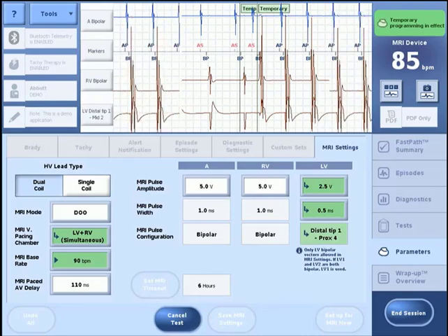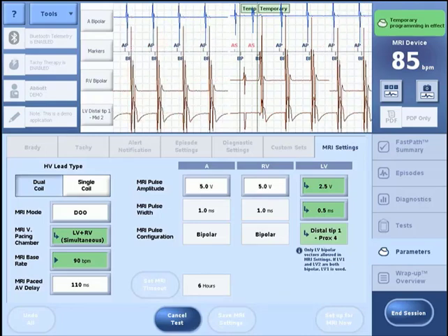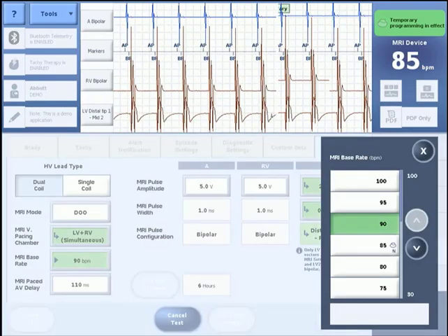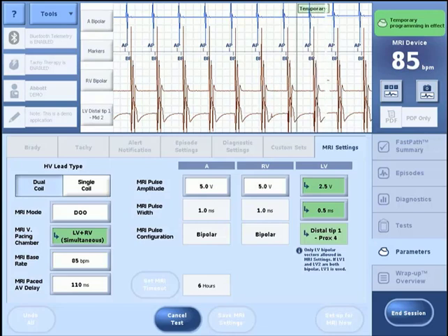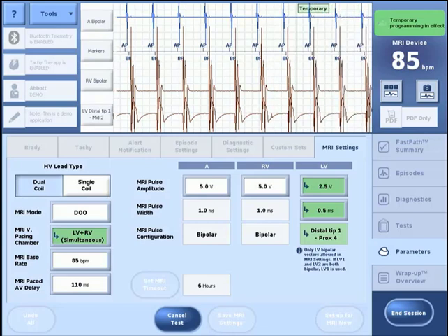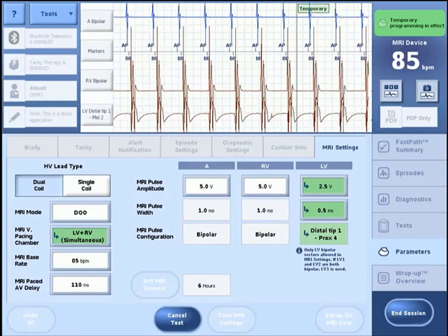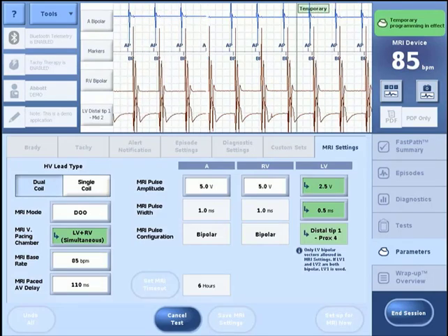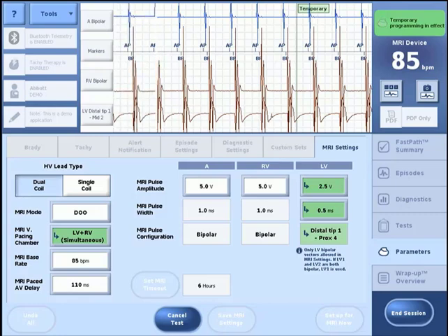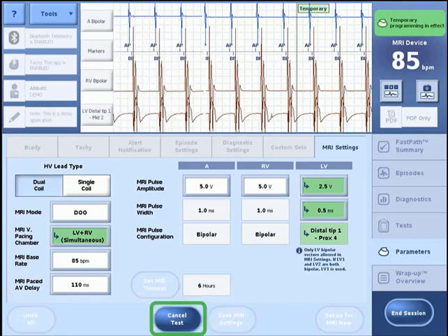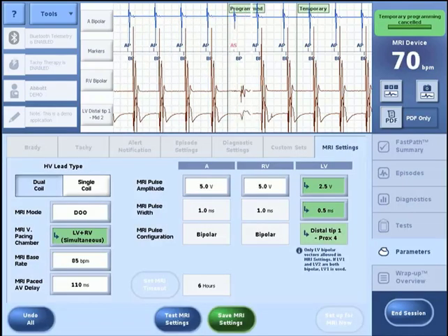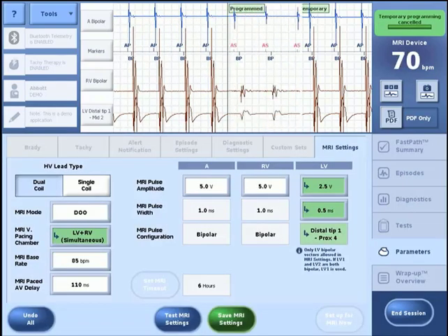The MRI pacing parameters may be tested by pressing the Test MRI Settings button. Temporary pacing is now in effect. Adjustments may be made to the parameters during this temporary test. Once confirmed that the chosen MRI pacing parameters are appropriate for the patient, press Cancel Test to proceed.